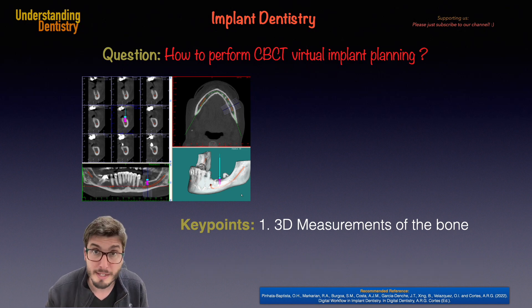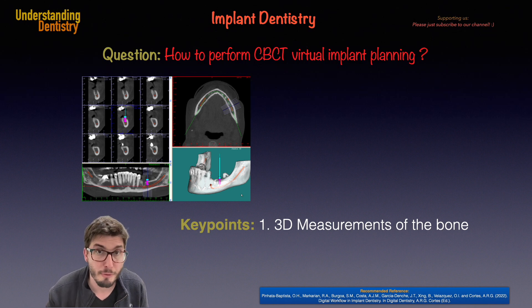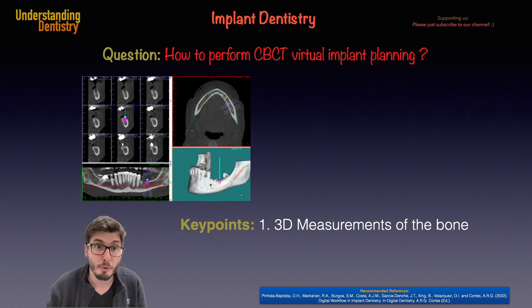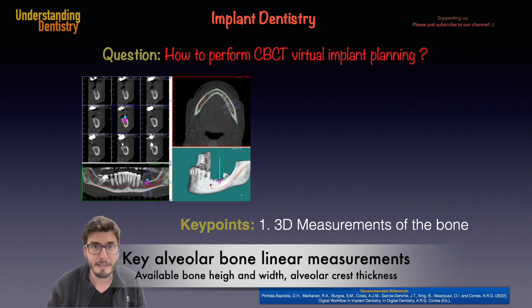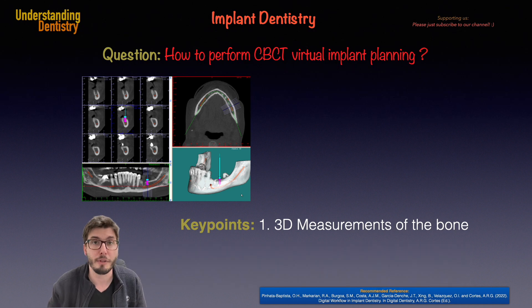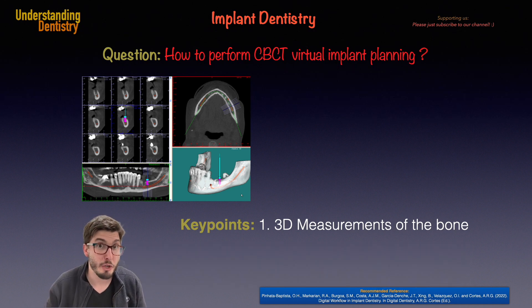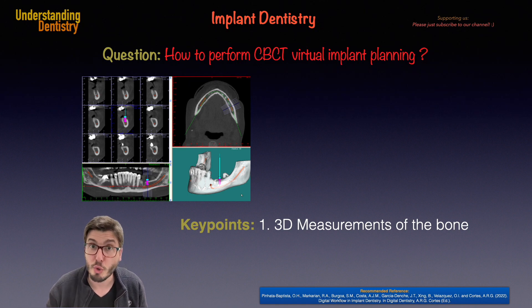The first key point is the 3D measurements of the alveolar bone. So we can perform linear measurements of the bone dimensions to plan our dental implant. The two most important measurements are the bone height available and the bone width available — the buccal-lingual width at the level of the alveolar crest. We can do those linear measurements with precision because CBCT has no significant distortion.